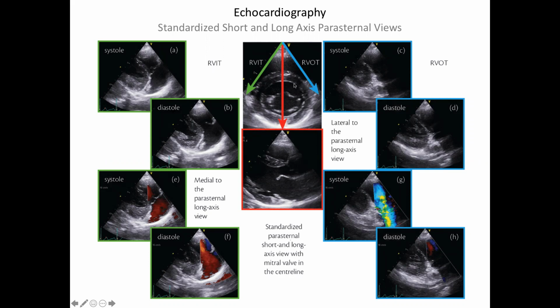And then, as I said before, once the tech has centered up and says, oh, okay, this is the right view that I need, they then just press a button and it'll record at that time, and then they lift, and that's captured and put in the database that the physician will read. And oftentimes you wind up with 50 of those recordings, right?